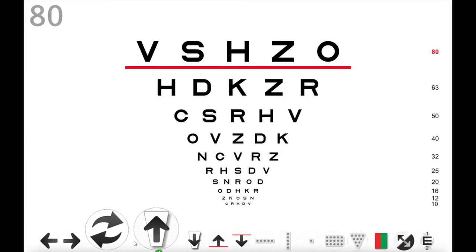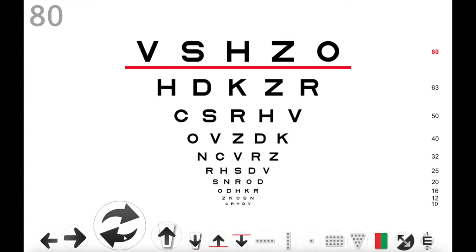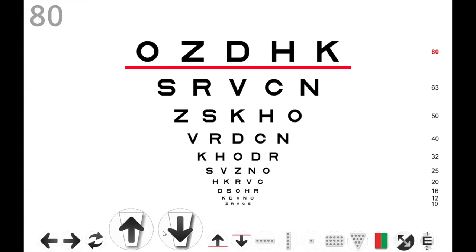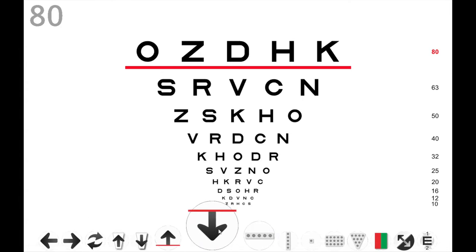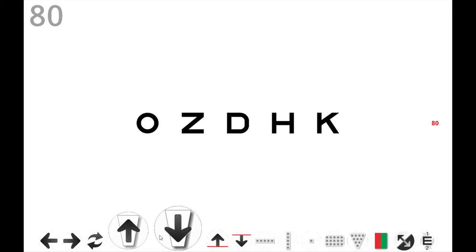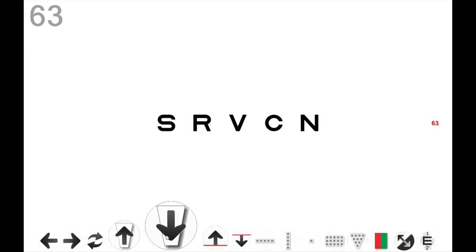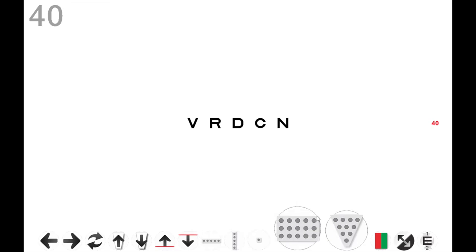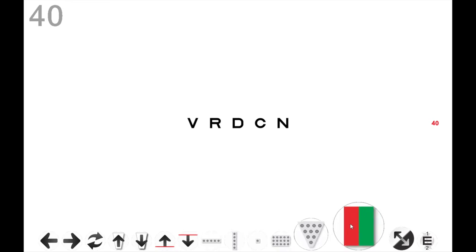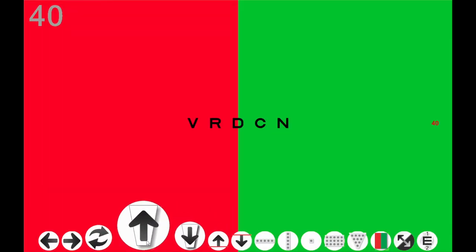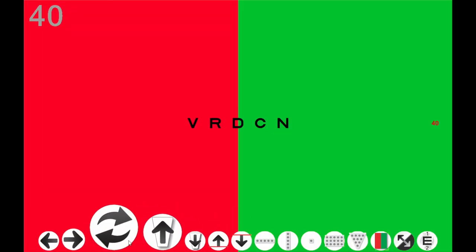Masking with the mouse: the bottom dock is context sensitive, and when a letter chart is displayed, you can mask by selecting any of the masking options. You can also randomize or change the letter sizes by pressing the larger or smaller buttons.